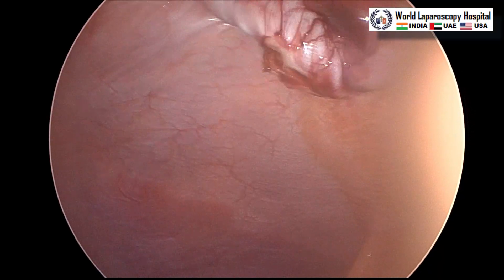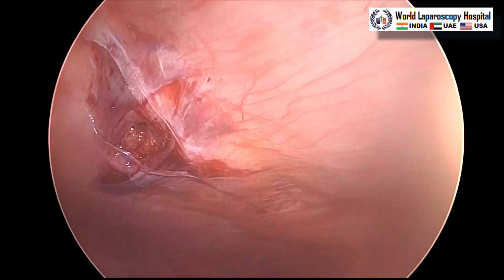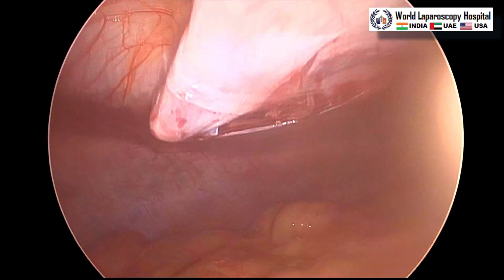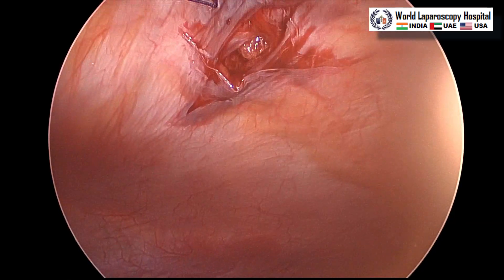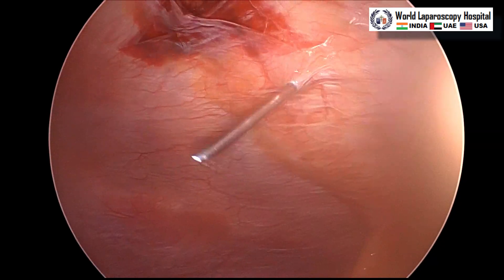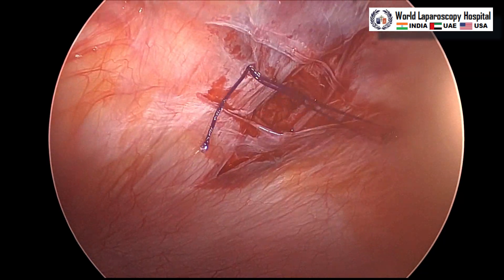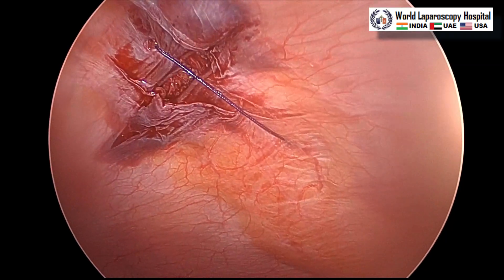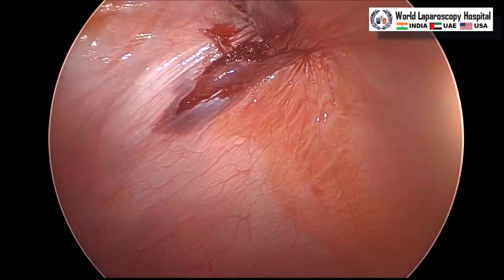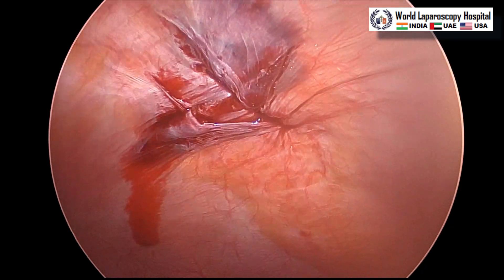It is essential now to close the port, because any port used for tissue retrieval will become dilated beyond 10 mm. Here we are using a cobbler's needle, piercing through the muscle including all layers, and from the other side we take the suture out with the cobbler's needle. Port closure is essential to prevent hernia — any port used for tissue retrieval must be closed. Now with a 5 mm telescope we are closing the port under vision. After that gas is removed and all ports are taken out. Thank you very much for watching this video; have a nice day.